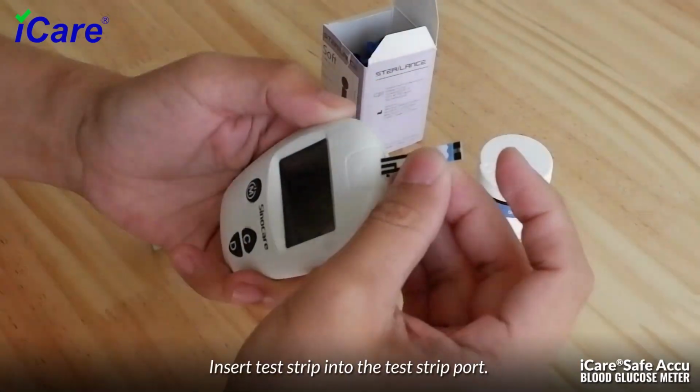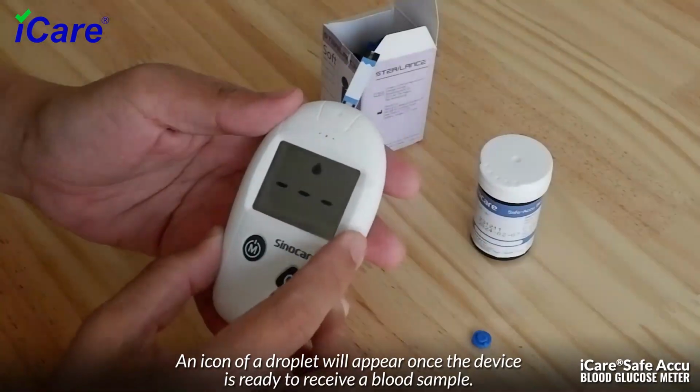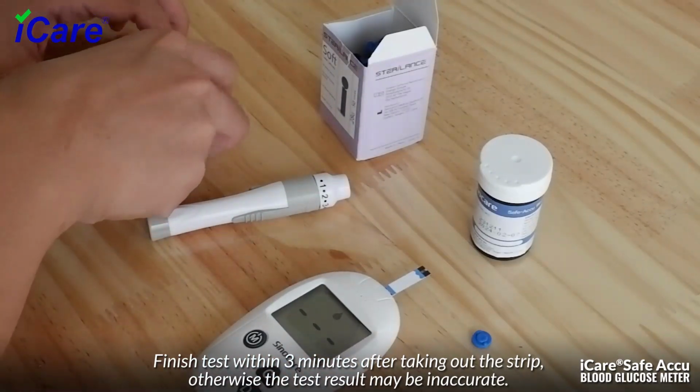Insert test strip into the test strip port. An icon of a droplet will appear once the device is ready to receive a blood sample. Finish test within 3 minutes after taking out the strip, otherwise the test result may be inaccurate.